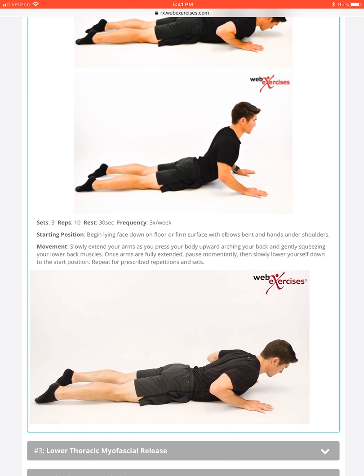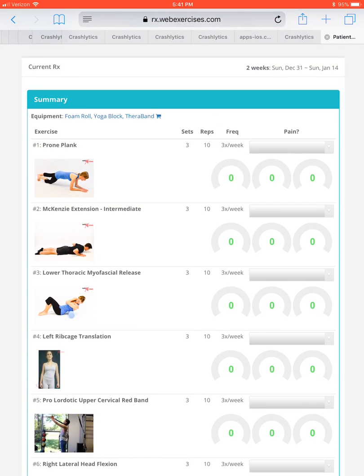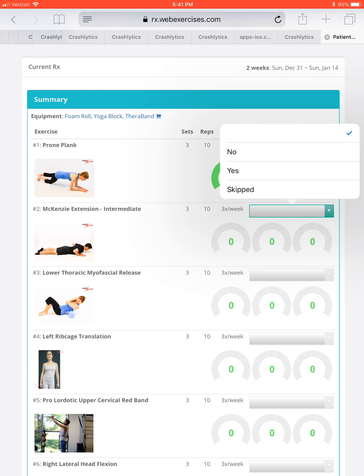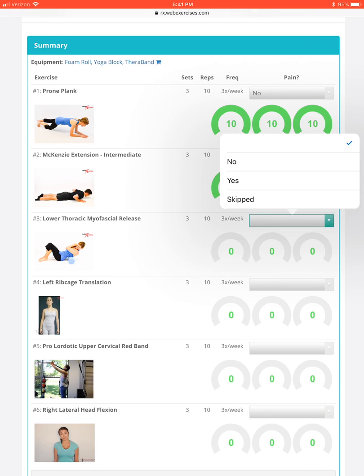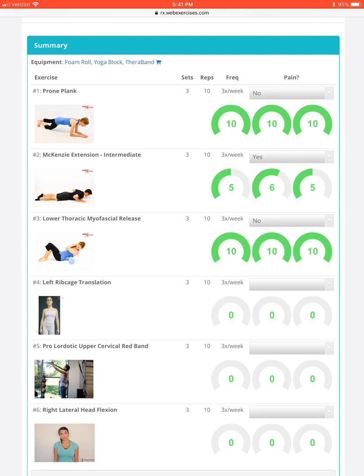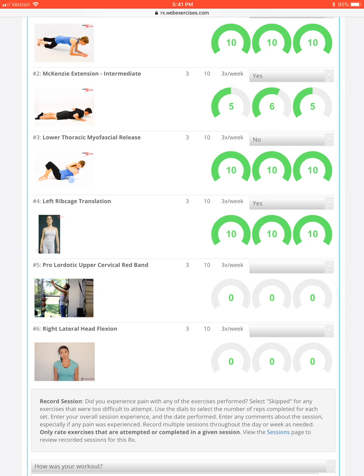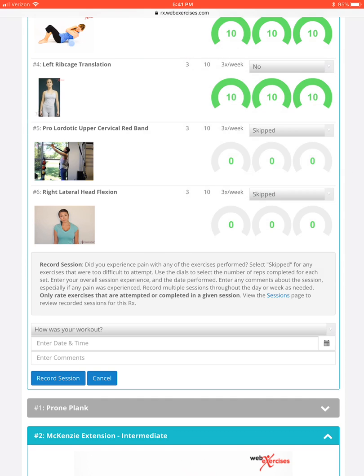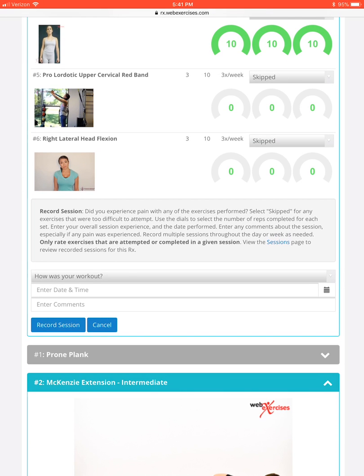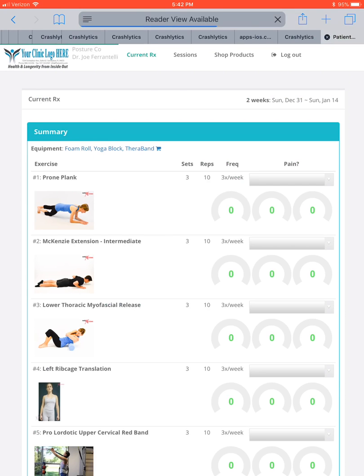Not only do you have the documentation, but you have compliance tracking — clients can log their sets and reps and indicate whether they had pain. For example: no pain and all reps completed on one exercise; pain and only a couple reps on another; no pain and all reps on a third; and marking others as skipped.